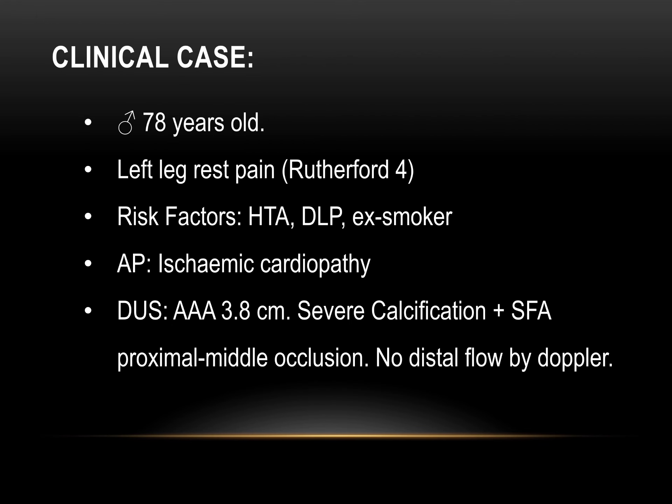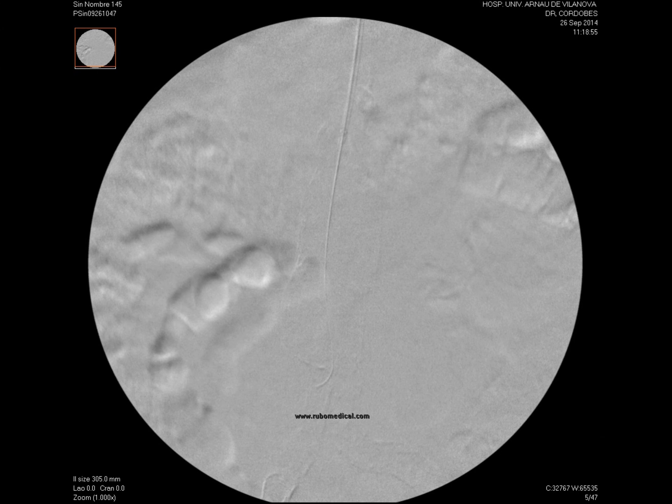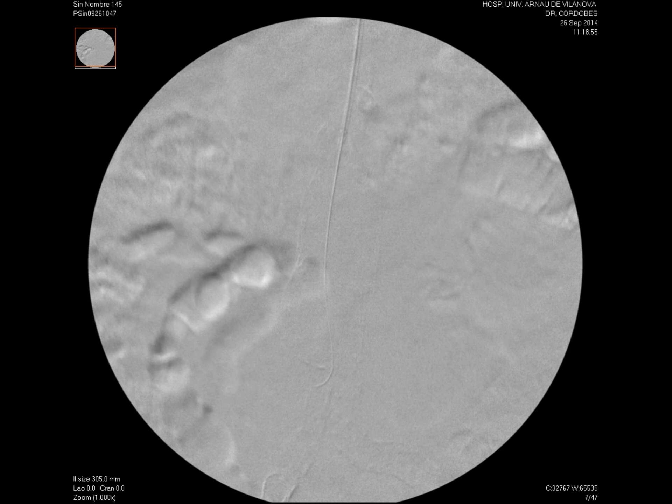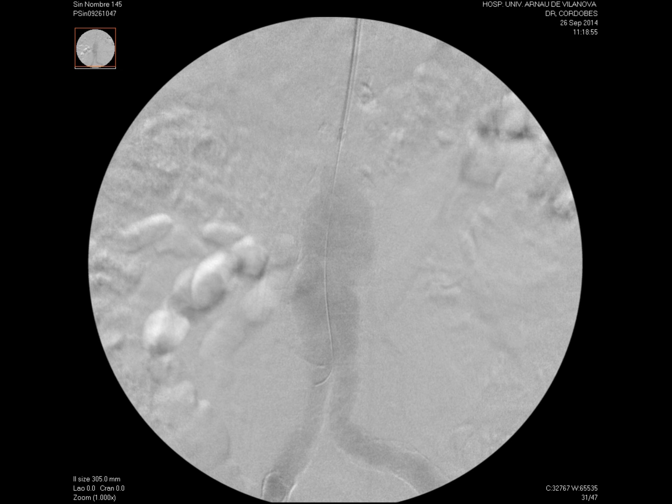The patient was a 78-year-old man with critical ischemia of the left leg presenting rest pain. He presented the usual risk factors, and the ultrasound study revealed a 3.8 cm abdominal aortic aneurysm, severe calcification of the iliac axis, and the superficial femoral artery. The study showed a critical stenosis in the proximal SFA and an occlusion at the distal SFA with absence of Doppler flow in the foot. The patient had a very closed iliac bifurcation with extreme calcification, so we decided on a brachial approach to treat the lesion in the proximal SFA as well as the distal occlusion, avoiding the contralateral route given the complex bifurcation.